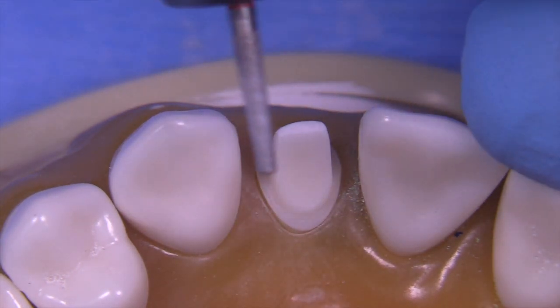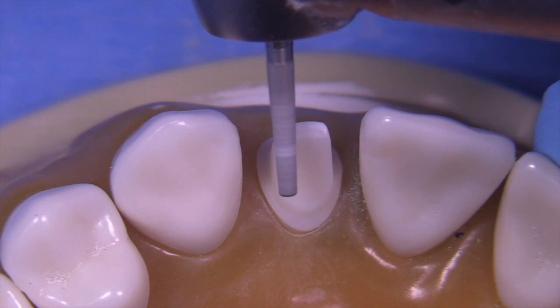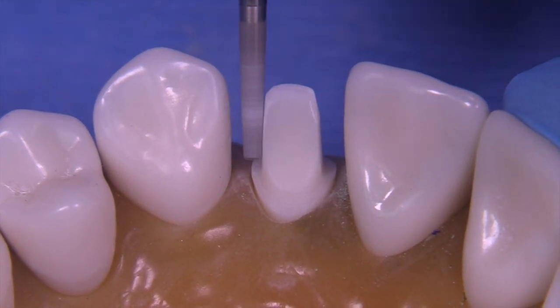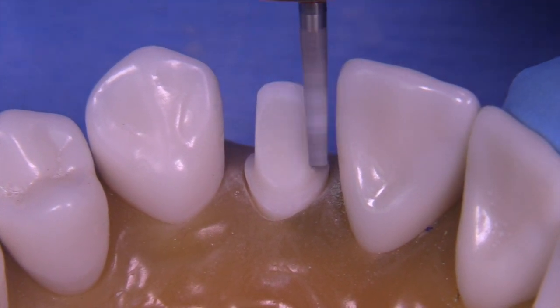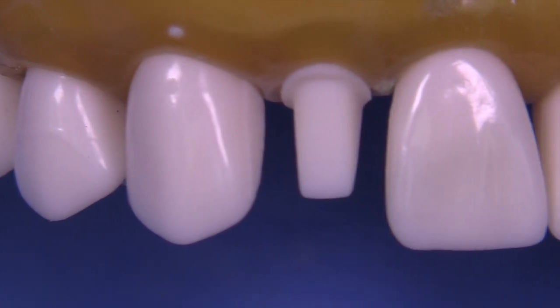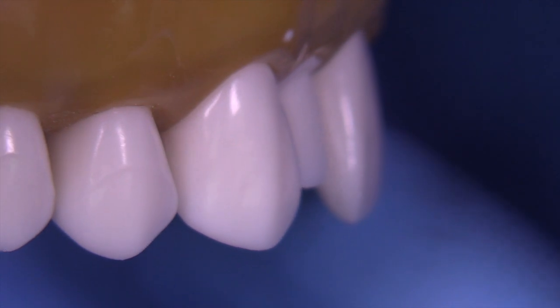After a few finishing touches I think we'll have a preparation that is pretty nice. I don't like sharp edges, so if we can bevel these little corners between the lingual and the proximal and between the incisal and the lingual, that's always a really good idea. This preparation goes pretty quickly because you're not reducing a lot of massive tooth structure, but it still has the same requirements for precision measurements, draw, smoothness, and all of those things in the final preparation as any other prep would have.